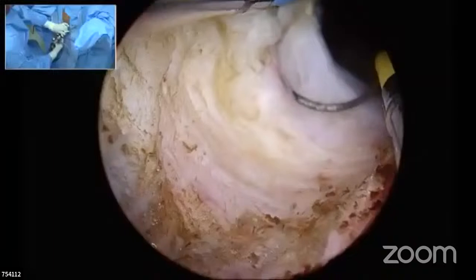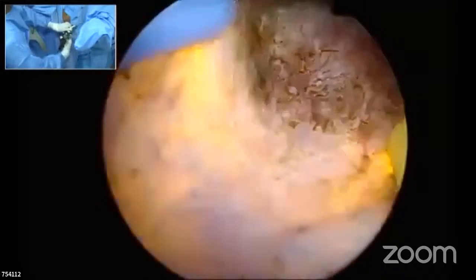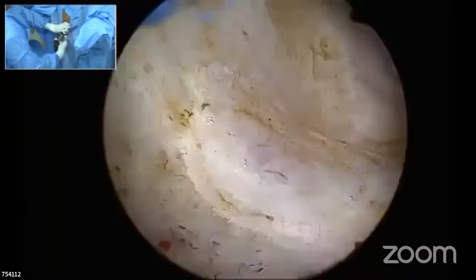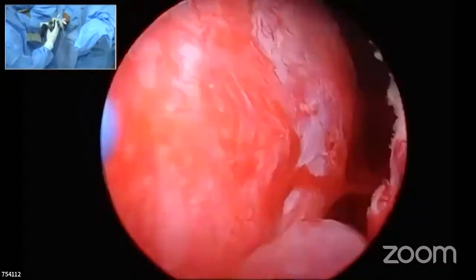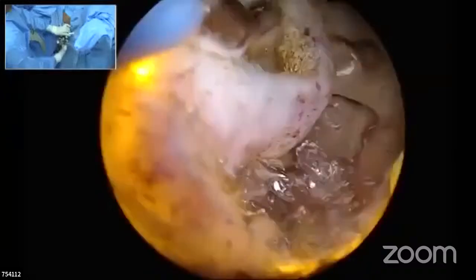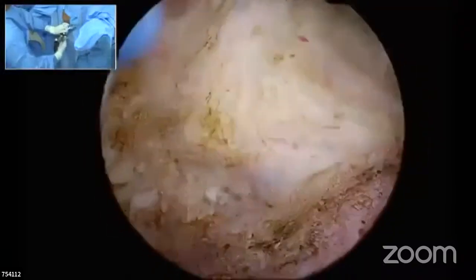The actual Nesbit teaching is to go all along the capsule. This is what Nesbit has taught everyone. So you go all along and drop the lobe into the cavity. But I would say, if you are a beginner, I would not advise this method because you may end up getting out across the capsule at any point of time. It is only for after a significant amount of experience.